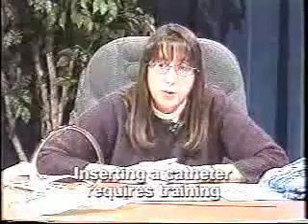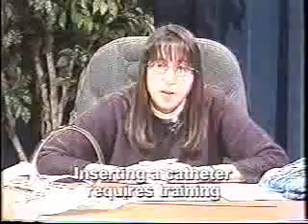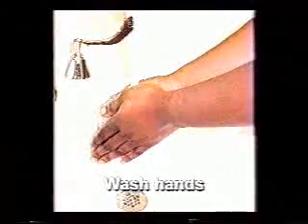A licensed nurse or a technician trained specially to insert a catheter will use sterile technique. As a caregiver, you are responsible for maintaining the sterile drainage system and keeping the system closed. When giving patient care, you must wash your hands before and after handling catheter equipment.